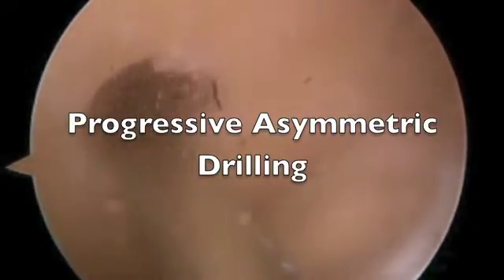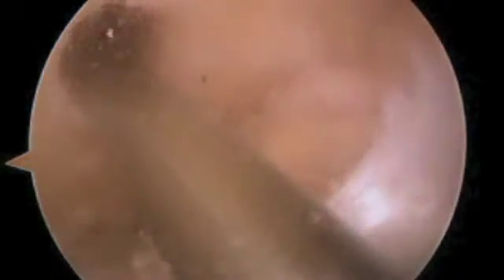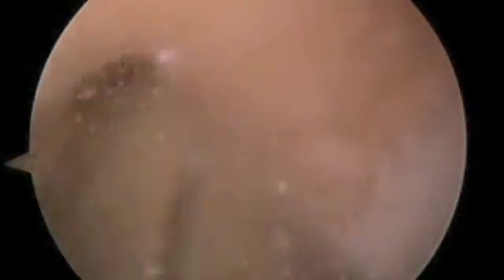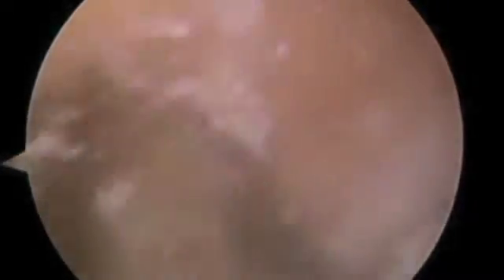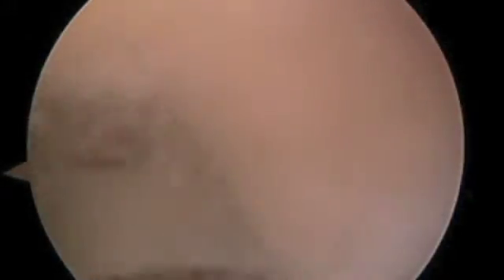The next step: I've got the guide pin and I'm going to use a 6.5 — progressive asymmetric drilling. As you can see in this picture, I can take that guide pin and lay it across the posterior aspect of this 4.5 tunnel, then move the pin to the anterior aspect of that tunnel. So I can asymmetrically ream this tunnel to guide the femoral tunnel placement. In this particular case, I'm going to posteriorize this — the 6.5 is not taking any bone from the anterior aspect of this tunnel; this is purely reaming posterior. I need to see the numbers for my fixation device — I need about 32 to 33 millimeters — and so I'm going to stop right about there.